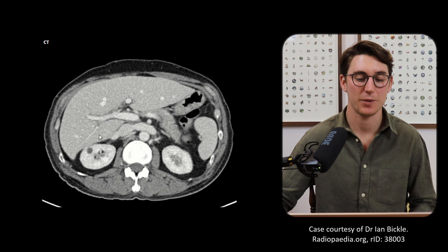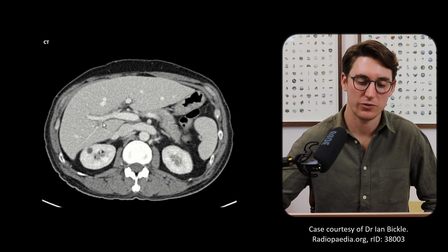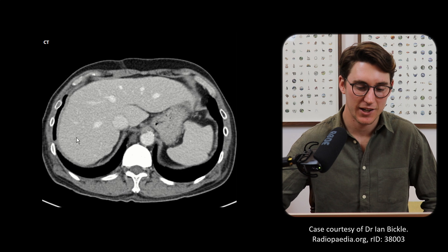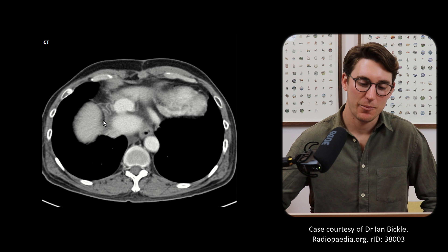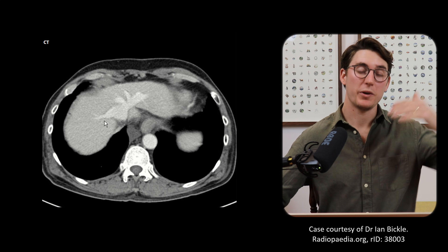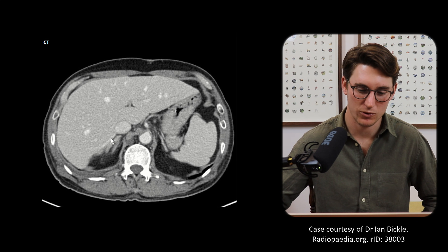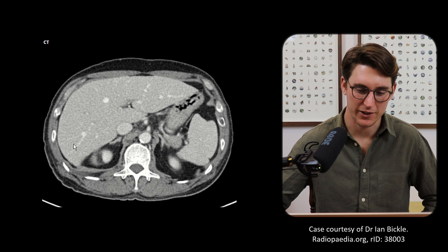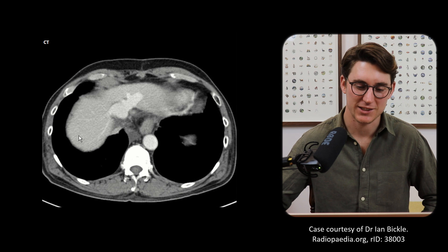Heading superiorly, getting to the level of the right portal vein, we know that above that this segment is all segment seven. Posterior to the right hepatic vein and superior to the right portal vein is our segment seven — all the way down until that level. And as we go up, this is all segment seven.